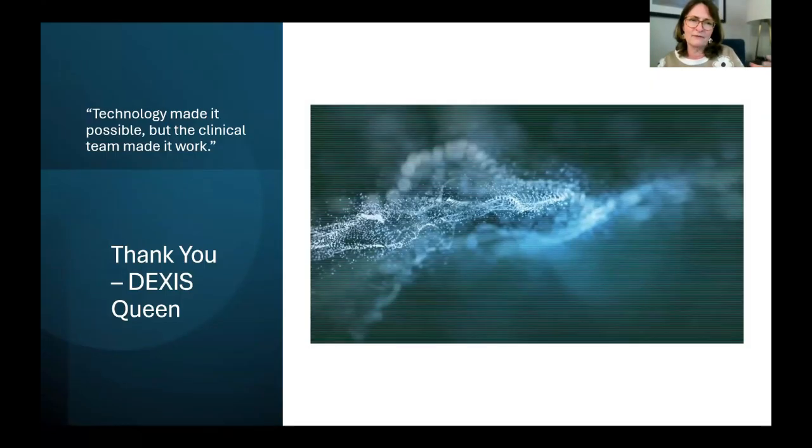I think it means, does it have to have the whole quadrant, like adjacent teeth? No, we only have to take an impression of the area that's missing data.